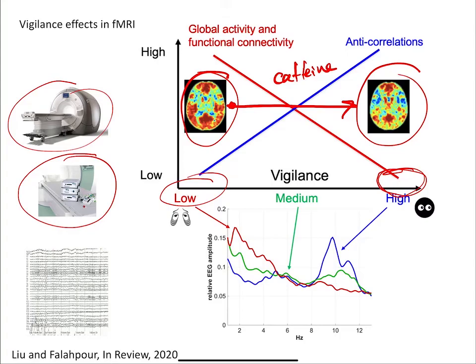Okay, so I think that's one thing, especially for those of you who are doing primarily resting state, be aware that there is this emerging area really looking at arousal effects. And even more, it seems like a lot of the, quote, motion-related artifacts that people have been publishing, especially like Jonathan Power, there is a recent paper coming out, it's already on bioRxiv, showing how a lot of those effects may just be due to arousal effects. Okay, they're not really motion effects, they're really arousal effects. So I think that's especially important for populations where, let's say, in development, there are going to be changes in vigilance, and then on the other end, as people get older, there are going to be changes as well.